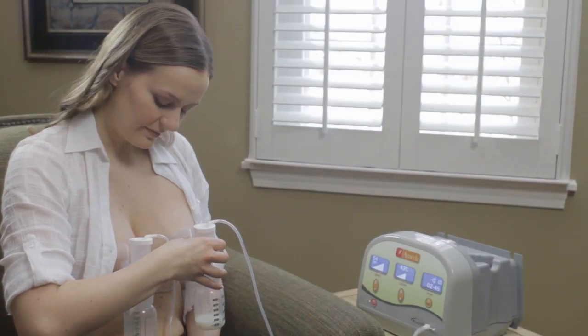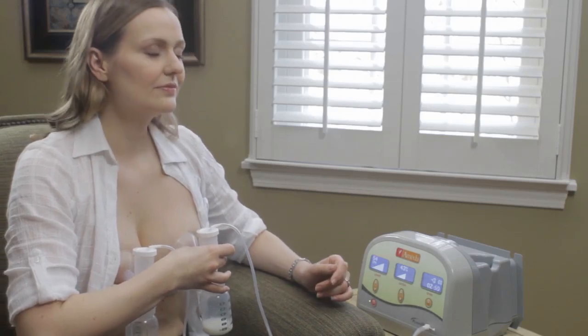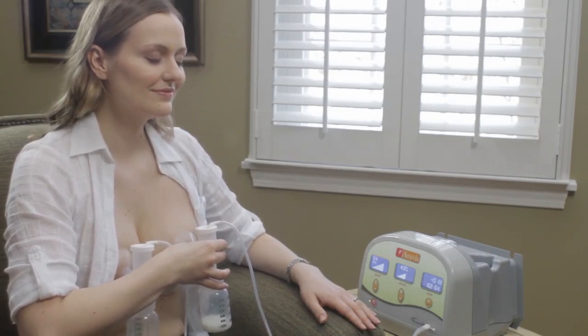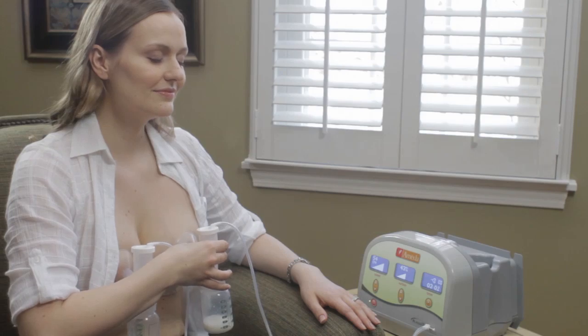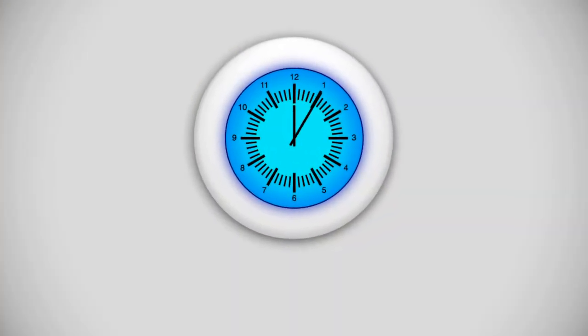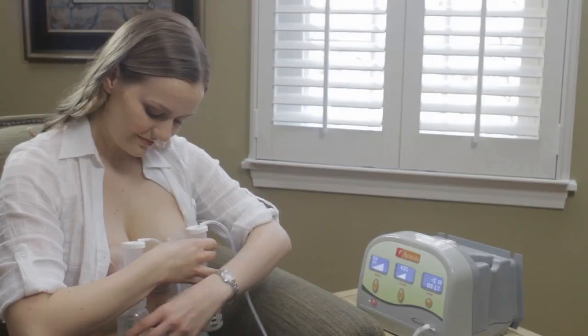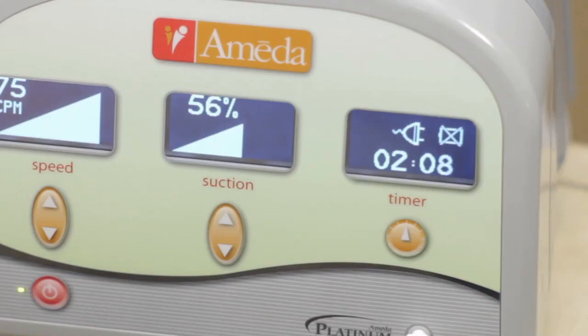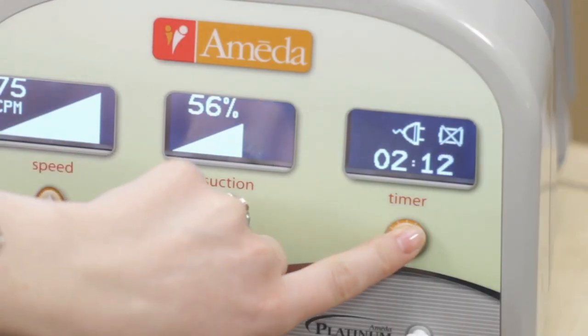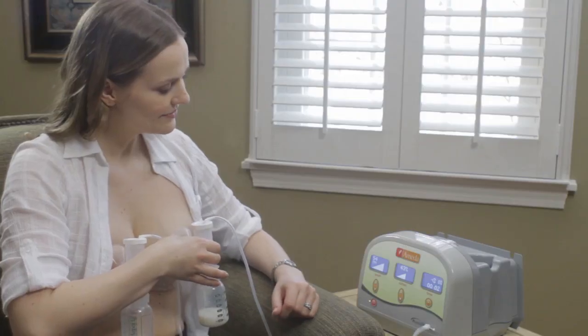As you pump, tilt the collection kit down slightly so your milk flows into the bottle. Close your eyes, relax, and imagine your baby nursing at your breast. Dual pumping takes much less time than single pumping. When dual pumping, allow 10 to 15 minutes per session unless your healthcare provider recommends another pumping time. If you single pump, switch breasts about every 5 to 7 minutes and allow about 20 to 30 minutes total per session. The Ameda Platinum Breast Pump features a timer that starts when the pump is turned on. It can be reset by pressing the button under the timer. The timer and pump automatically turn off after 60 minutes.